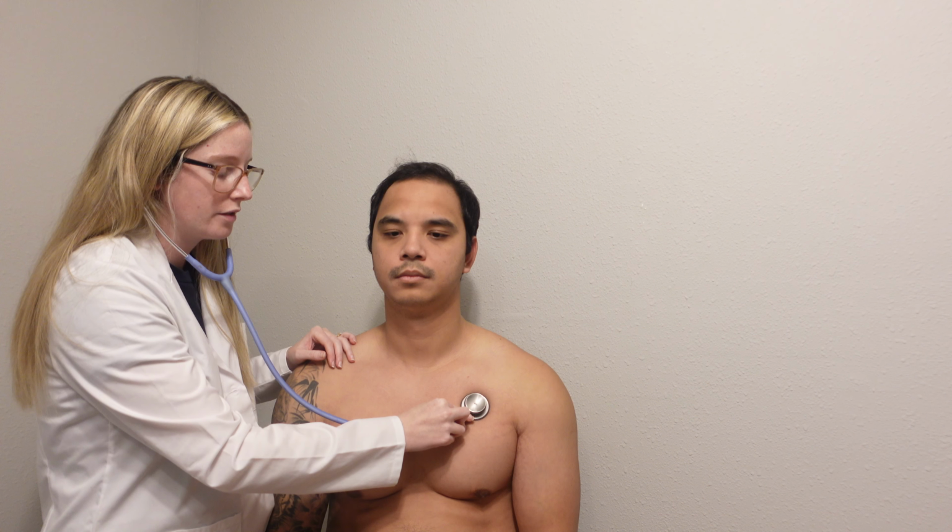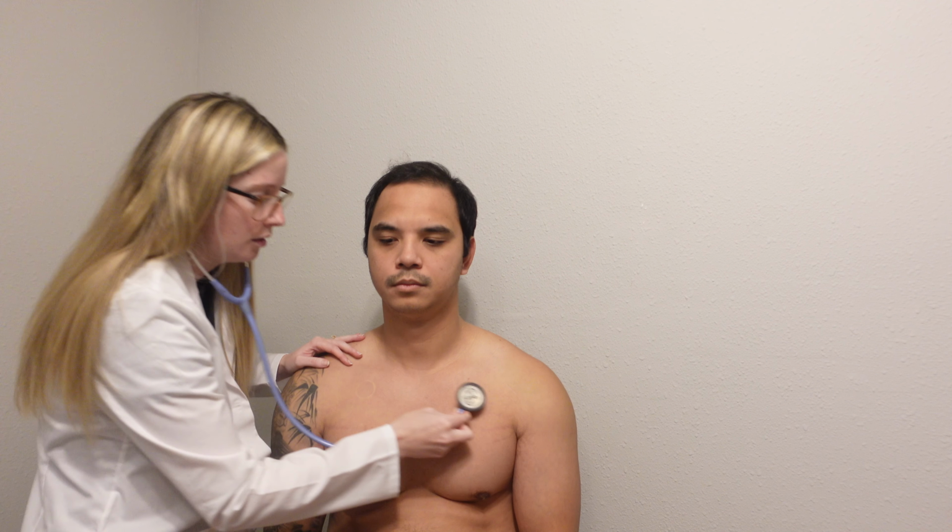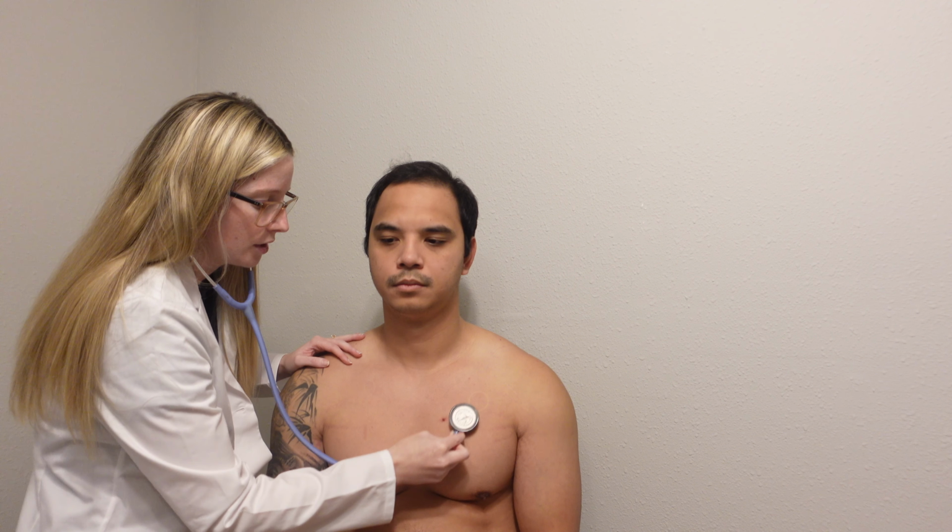So I'm going to start about 2nd intercostal space on the right. And then I'm going to go over to the 2nd intercostal space on the left. And then I'm going to kind of just slowly inch down each space. So the 3rd, the 4th, and the 5th, and then the apex of the heart. Okay, and I'm going to do the same thing, but listen on the other side of my stethoscope as well. And just inching down.